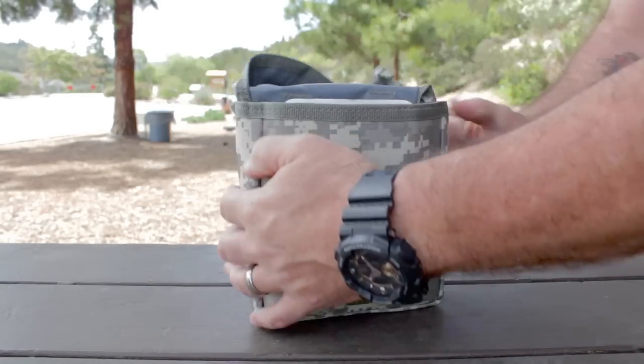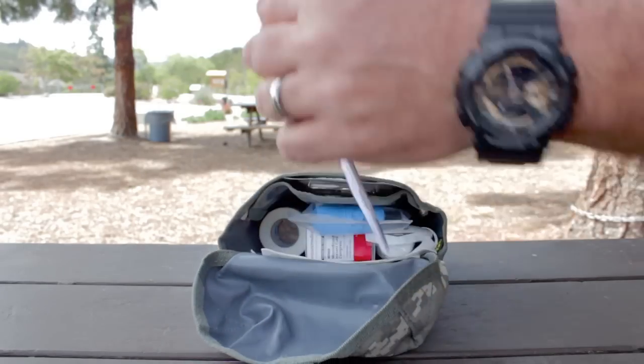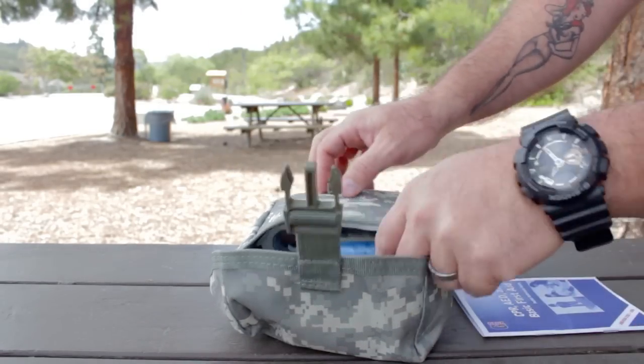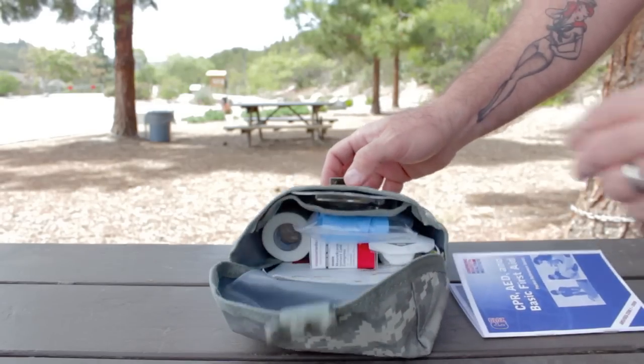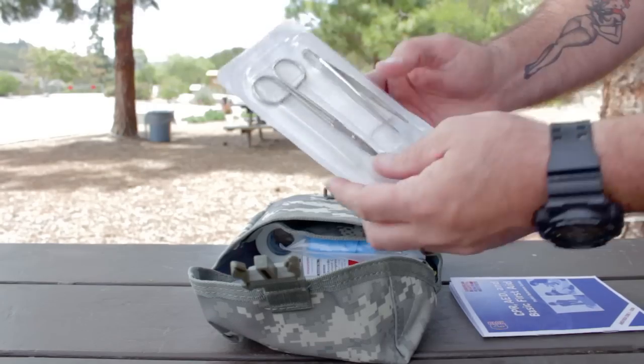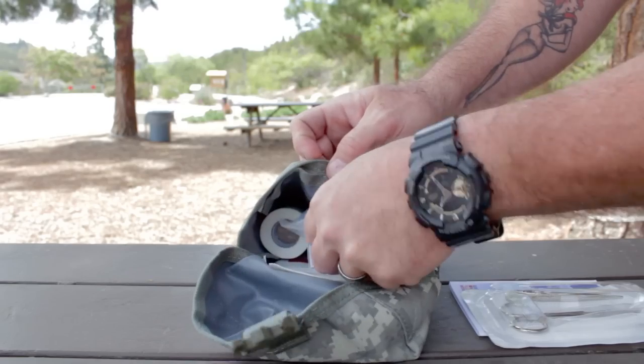The kit comes with a Voodoo Tactical MOLLE-compatible pouch and it comes in a variety of different colors. There's a total of 42 items that came in this kit. First is a first aid instruction manual — though it won't replace training, it comes in handy in a stressful situation. Second, there's a pair of scissors and tweezers, which are a must-have in any first aid kit.